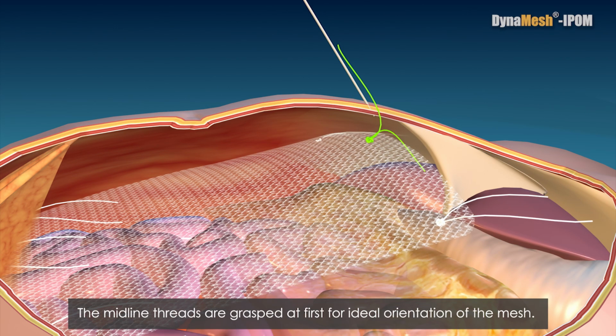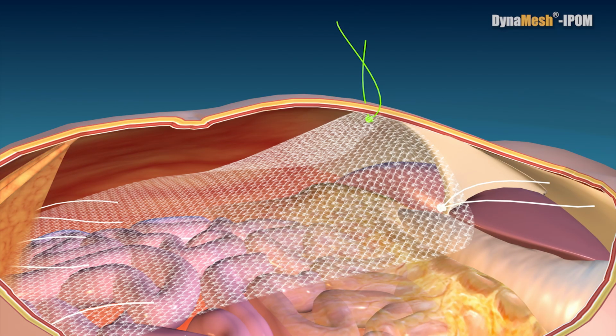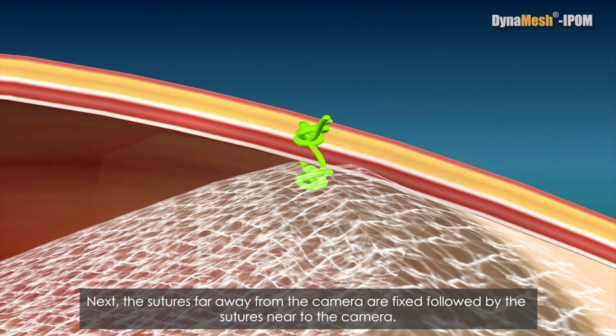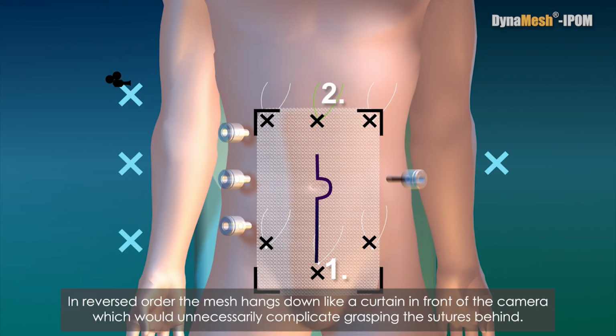The midline threads are grasped at first for ideal orientation of the mesh. Next, the sutures far away from the camera are fixed, followed by the sutures near to the camera. In reversed order, the mesh hangs down like a curtain in front of the camera, which would unnecessarily complicate grasping the sutures behind.